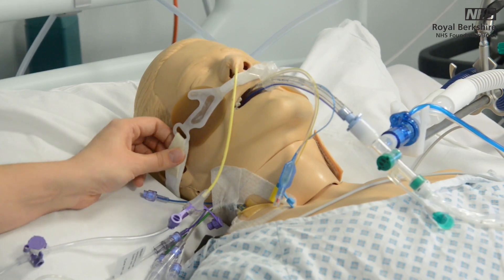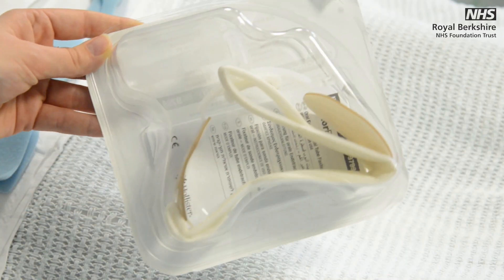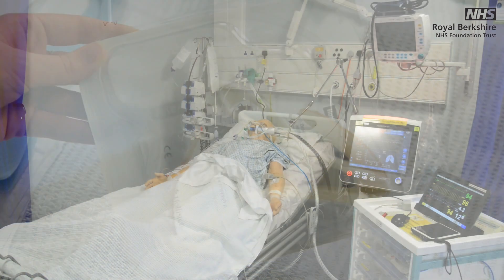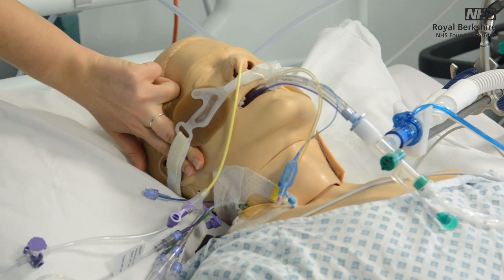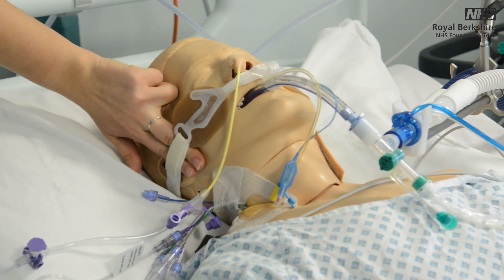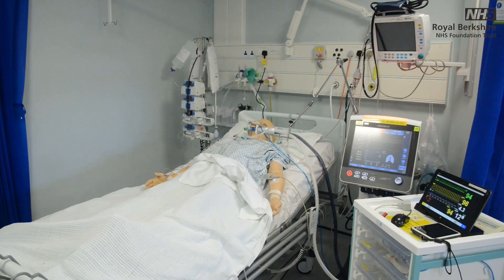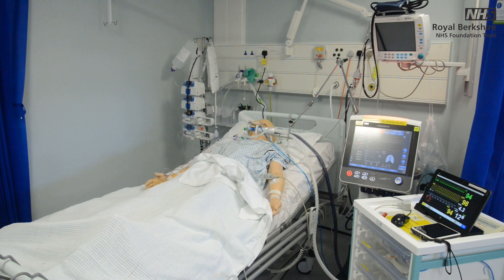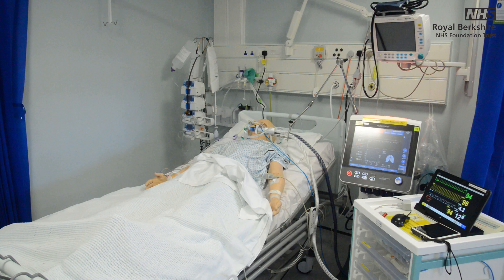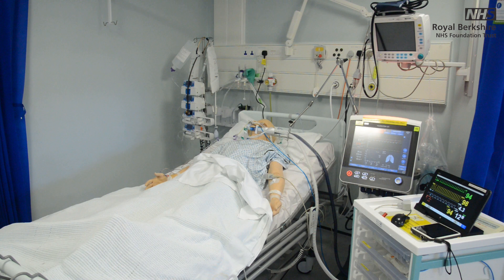When checking the endotracheal tube, first check that it is secure and tied appropriately with tapes or a device used in your trust. Regularly check the tapes have not become loose — you should only be able to get two fingers between the tube ties and the patient. If there is excessive space, you should re-tie the tapes. Tying the tapes is a two-person technique to prevent accidental extubation, with one person holding the tube and one person tying the tapes.